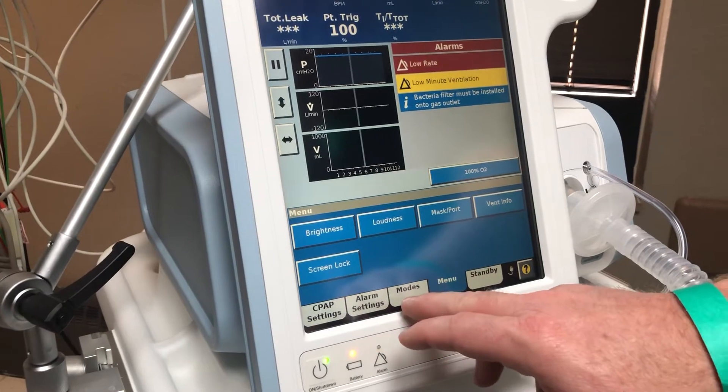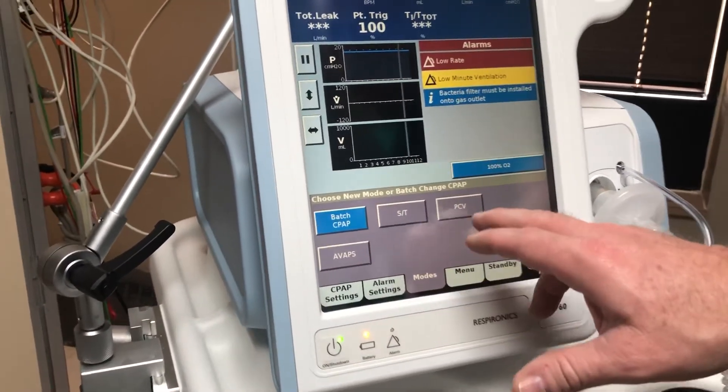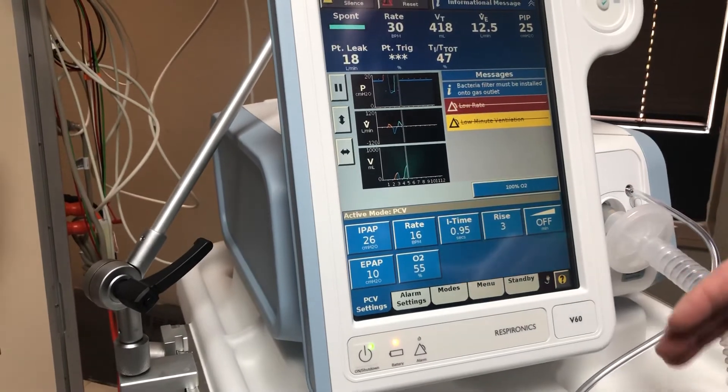Now we're going to modes and here are the different modes. For our purpose, we're going to select pressure control ventilation — PCV — and we're going to accept that. Now we're in pressure control.